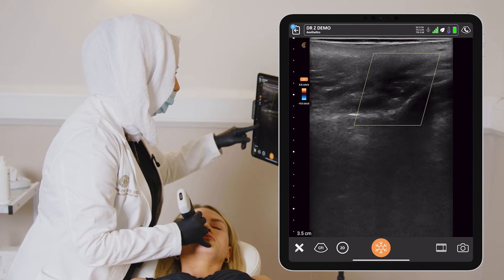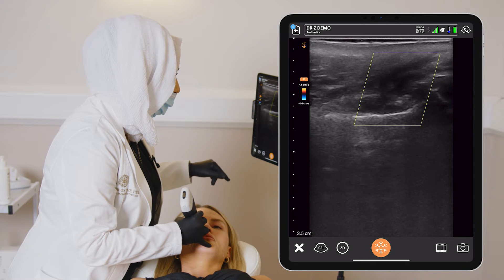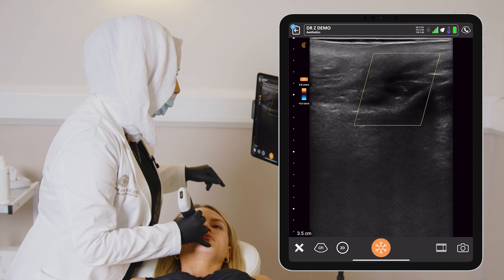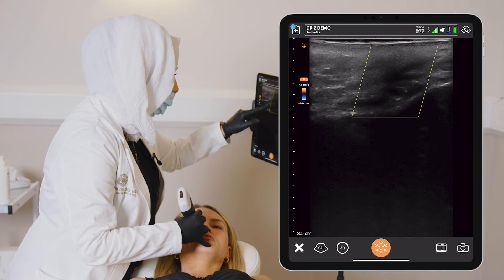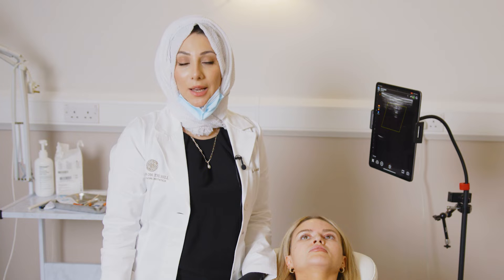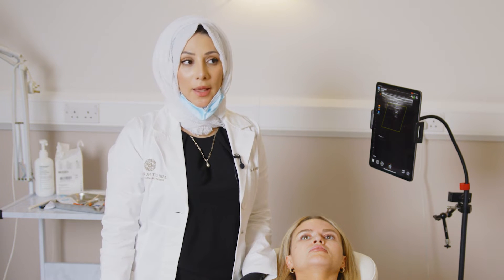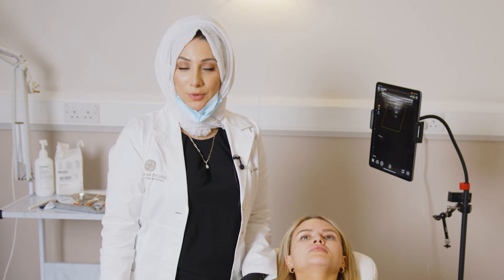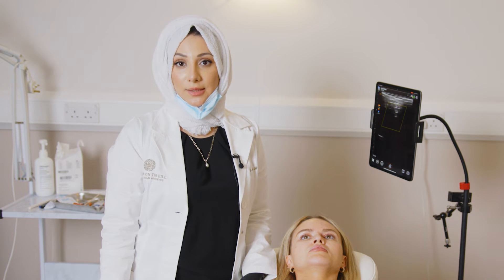Now going back right to the piriform fossa, which is here where my previous filler you can see very clearly — I cannot see a vessel on bone. So I'm happy to inject there using all the other precautions. Having scanned the piriform fossa along with the nasolabial fold, we could see the course of the angular artery. The angular artery does not sit on the periosteum, and therefore I'm going to proceed to inject the periosteum to lift the piriform fossa and project this region.